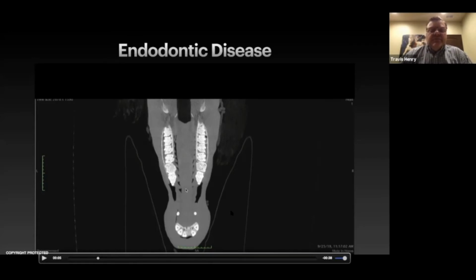When we performed the oral exam on this horse, we saw that the teeth in the 7 position here were kind of dysplastic. So you can see how the pulp horns are kind of crammed over towards the buccal side of this tooth, and then there was a production of cementum on the palatal sides of these teeth. Also, we had a missing incisor that we can see here. So kind of giving you a background on this horse's clinical exam.